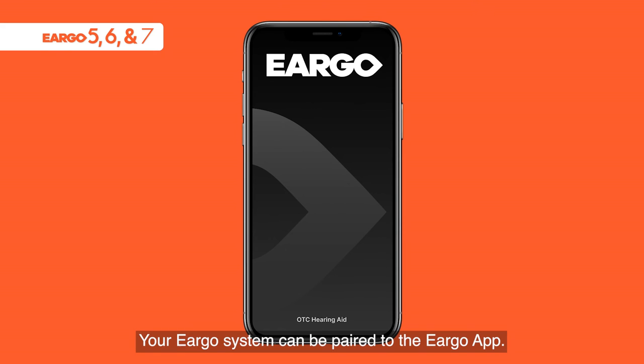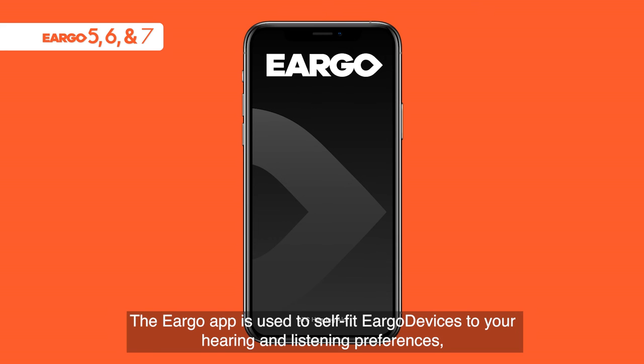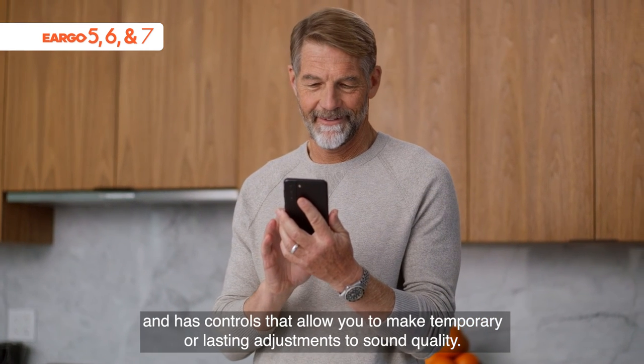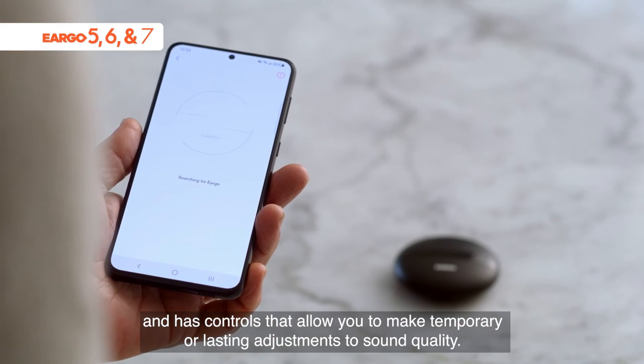Your Eargo system can be paired to the Eargo app. The Eargo app is used to self-fit Eargo devices to your hearing and listening preferences and has controls that allow you to make temporary or lasting adjustments to sound quality.